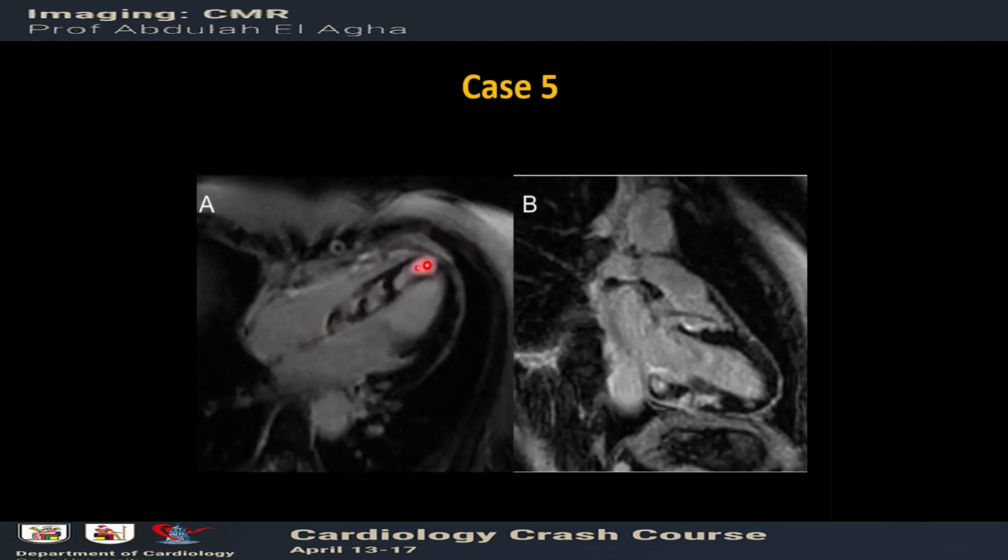So when you find this in the patient, taking the septum, especially with a predilection for the septum, this is a case of cardiac sarcoidosis. So this is a spot diagnosis in cardiac MRI. Although there are other cardiac MRI criteria for cardiac sarcoidosis, this is the major thing when you have this in the exam.